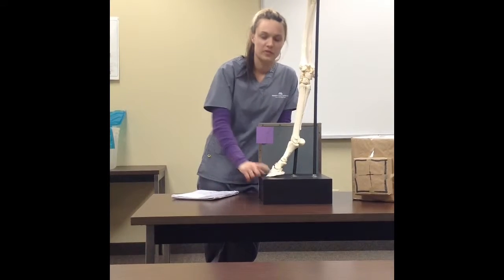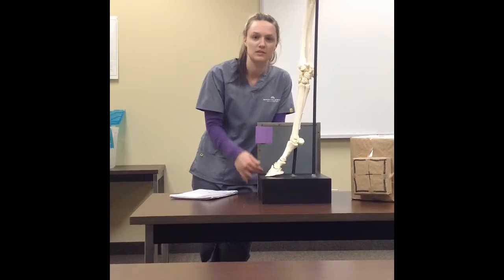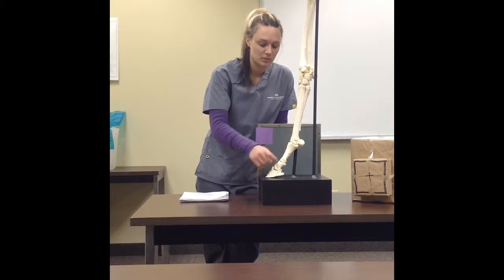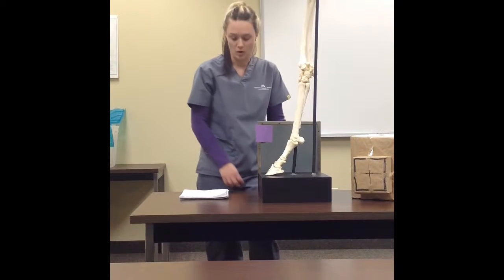The horse is going to be standing with the limb of interest and the contralateral limb on wooden blocks. A plate handler is not needed for this position because it can be placed in the wooden block in the positional slot. The focus is going to be all the joints and bones in the foot, including P3, P2, distal P1, navicular bone, distal and proximal interphalangeal joints, as well as the hoof wall.